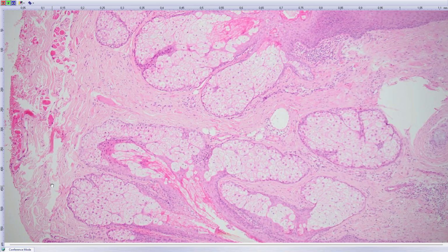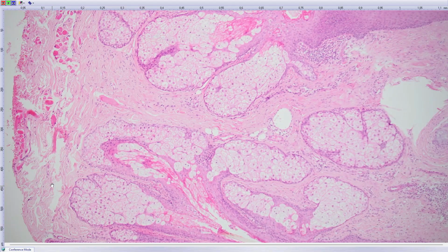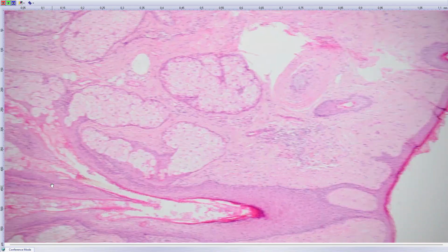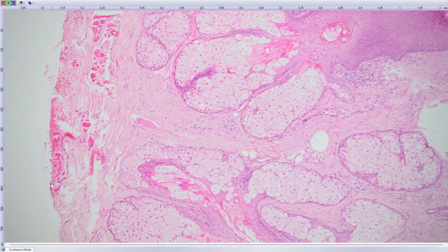I just think that the pathologist made a mistake. It was not epithelioid angiomyolipoma, it was an oncocytic epithelioid tumor, typical for this syndrome. It is another example of Birt-Hogg-Dubé syndrome. In this case, I don't see any spindle cell proliferation looking like spindle cell lipoma, like I showed you in past seminars.